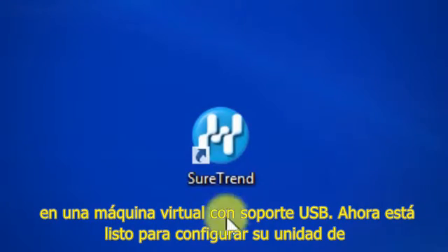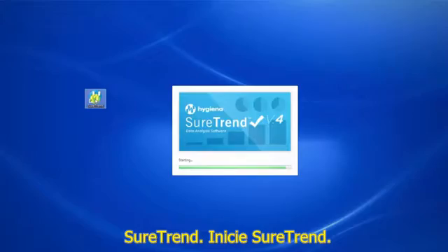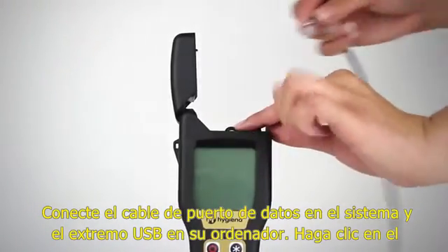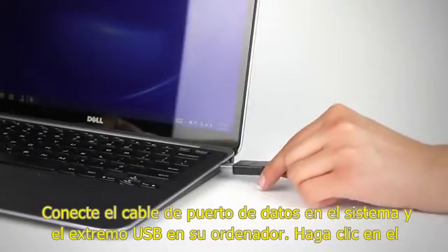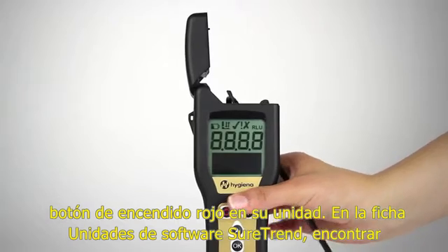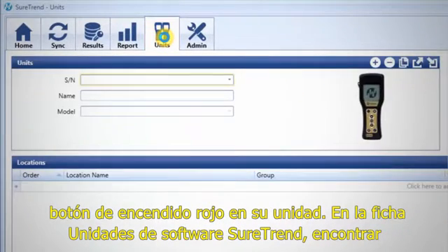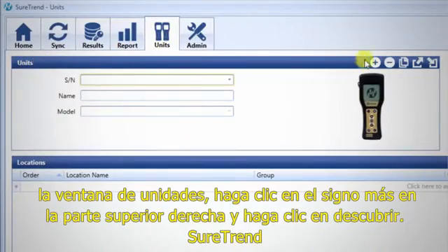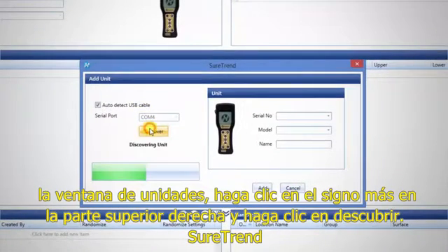Now you're ready to set up your unit in SureTrend. Launch SureTrend, then plug the data port cable into the system and the USB end into your computer. Click the red power button on your unit. On the Units tab of SureTrend software, find the unit's window, click the plus sign on the top right, and then click Discover.